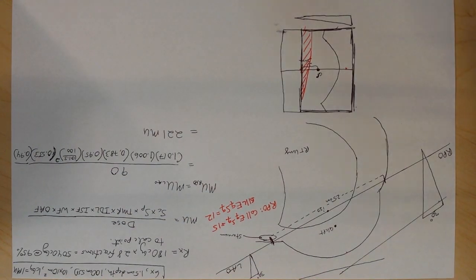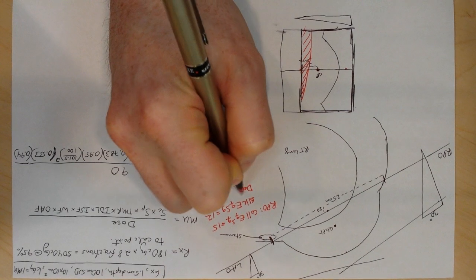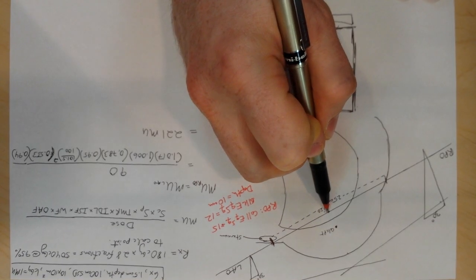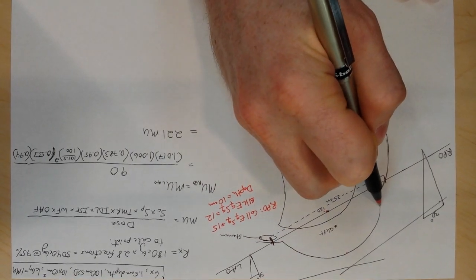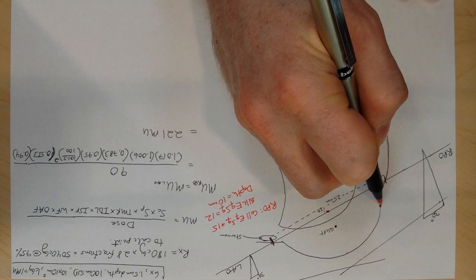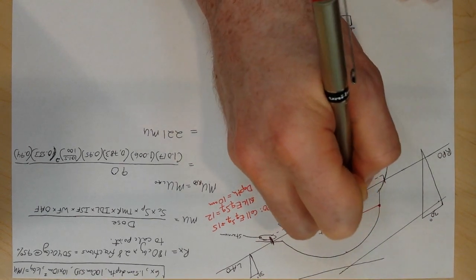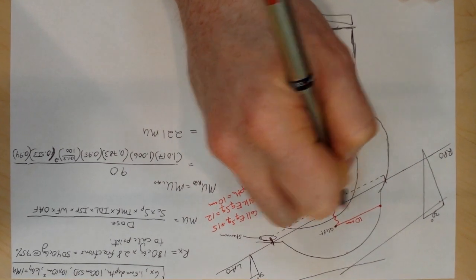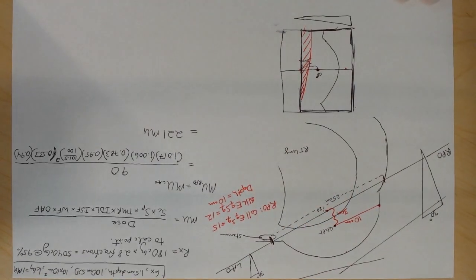Okay. The other condition that I'm going to give you is my depth of calculation point. My depth to the calc point is going to be 10 centimeters. So again, that's not here to here, that's here to here is 10 centimeters. Okay. My off-axis is 3 centimeters.